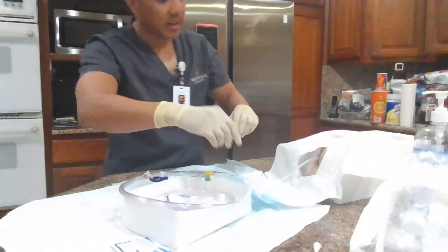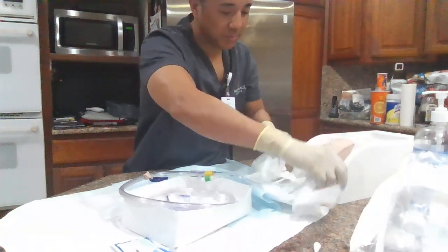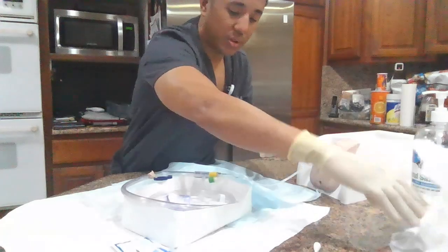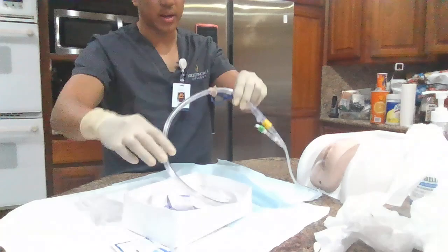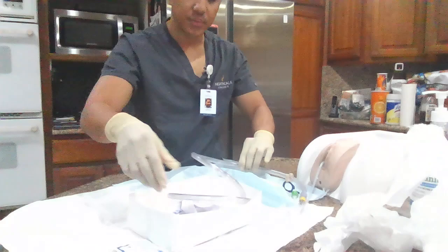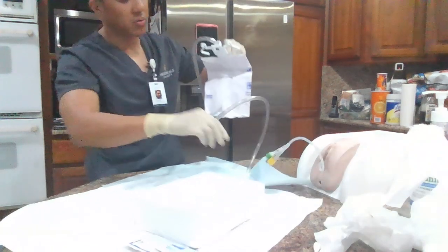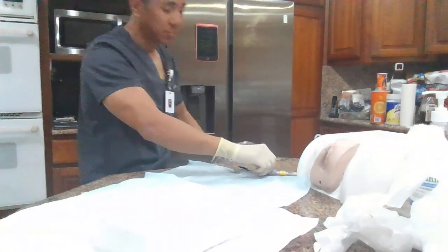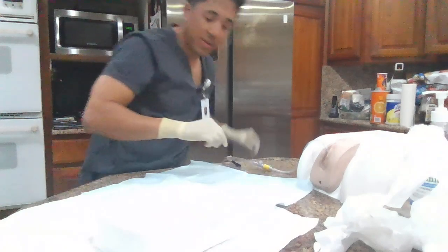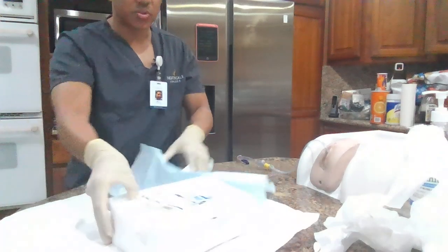Okay. And now, Mrs. Smith, I'm going to perform perineal care. Okay. I'm going to take the tubing and place it onto the inner thigh of the patient's right leg, and I'm going to take her drainage bag and place it onto the unmovable part of her bed, making sure that the drainage bag is lower than the patient's body. Okay, and then I'm going to take my supplies and dispose of them into the garbage.